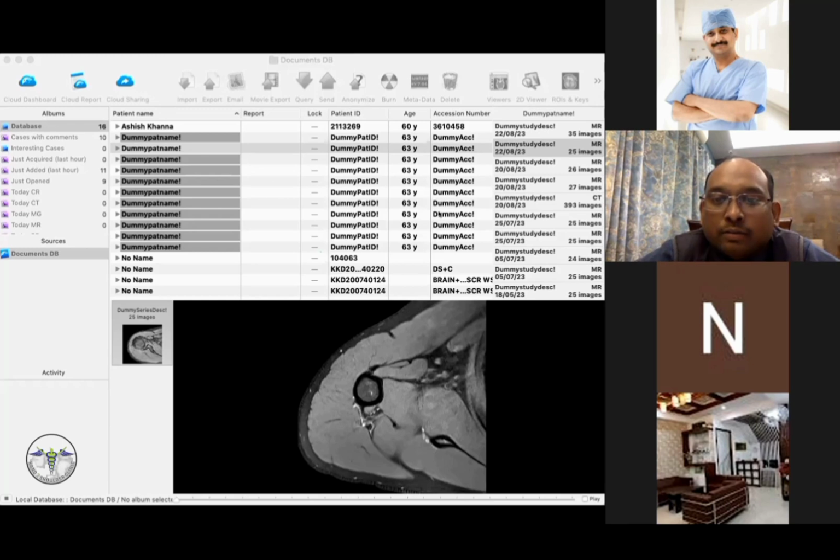One thing from my side, you said that when there is a large bony defect, you go for a bone graft or a different procedure, rather than soft tissue. We have also done a thesis 4-5 years back, and there are papers which say that in the Bernageau view we can see glenoid bone loss very nicely if it is more than 15%. If clinically you are very sure there is no other abnormality other than the glenoid bone loss and the Hill-Sachs, would you prefer going directly to the OT with just a Bernageau view, if there is more than 15% bone loss seen on the X-ray?